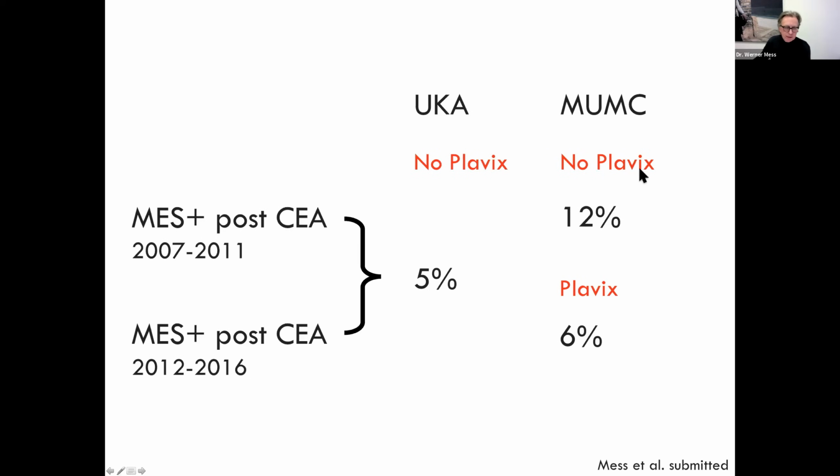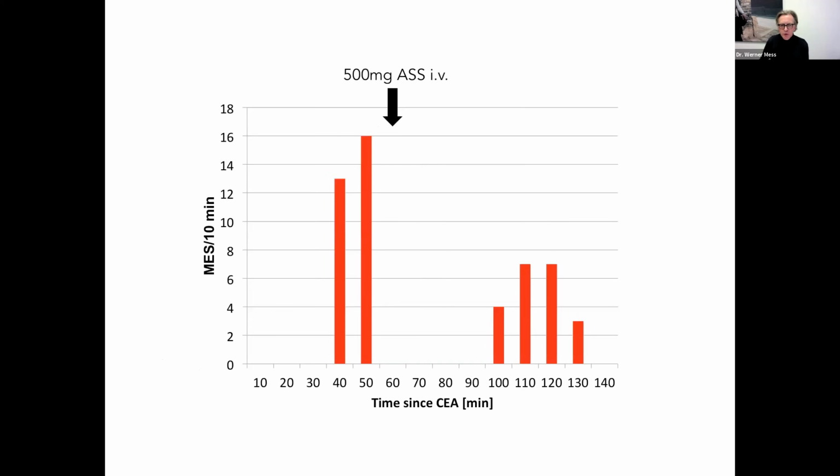So we have less microembolic signal positive patients postoperatively. But it also shows us that it's not that easy to compare the results from one hospital to the other. So I think this means you should gain your own experience and try it by yourself, how it works. But I think it is useful to do this postoperative monitoring, because of what we do now.